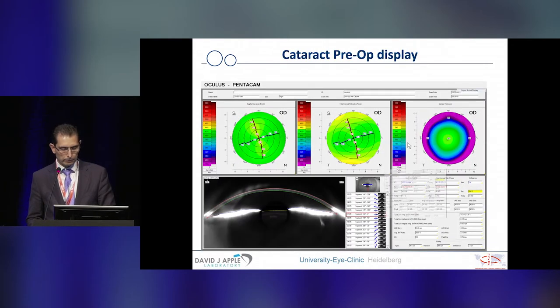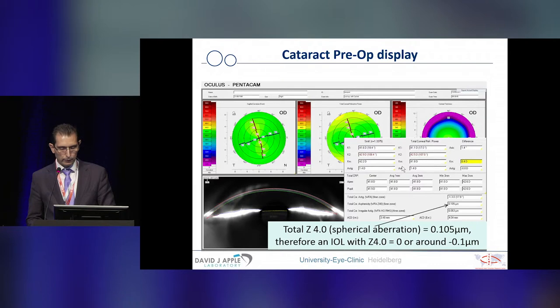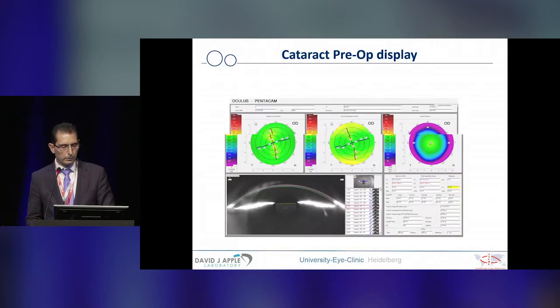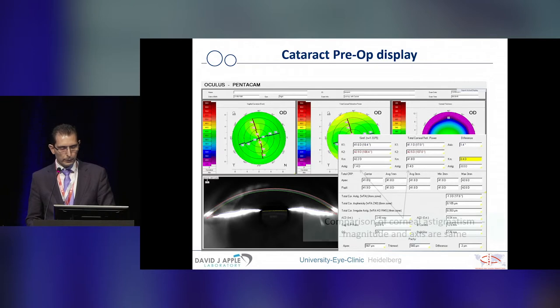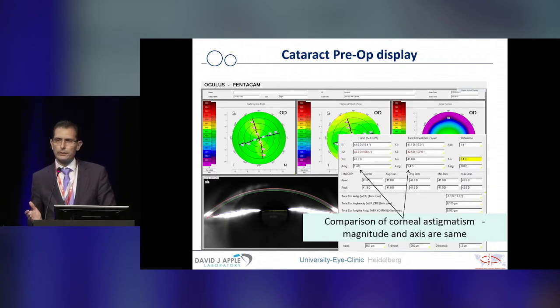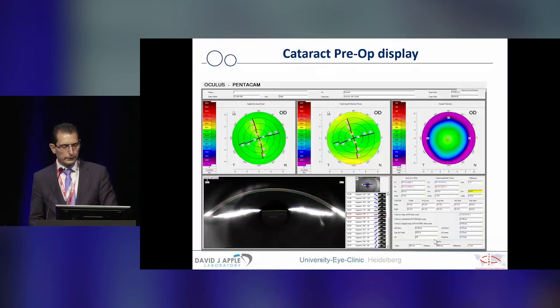The next step focuses on higher-order aberrations and spherical aberrations — when we want to address the wish for enhancing depth of focus using asphericity-correcting lenses, or if we want to leave the patient with their current asphericity. Finally, we look at the difference between the anterior segment and the total corneal refractive power with regard to maximum astigmatism axis, to see whether the axis is the same or if we have to change our decision when implanting a toric intraocular lens.